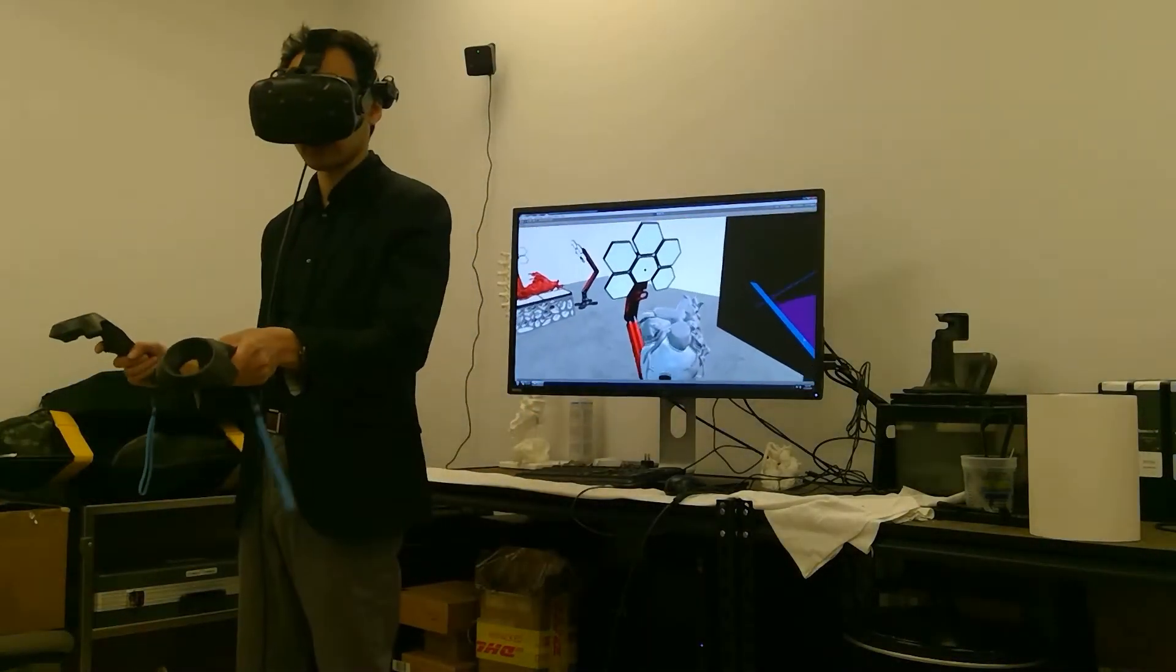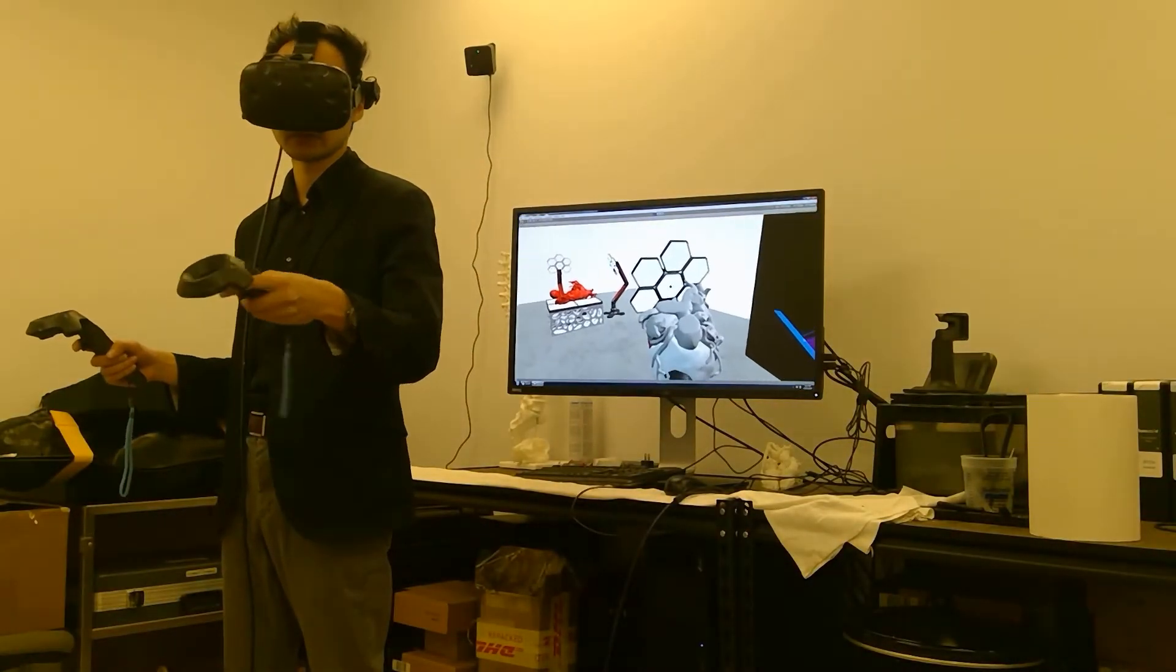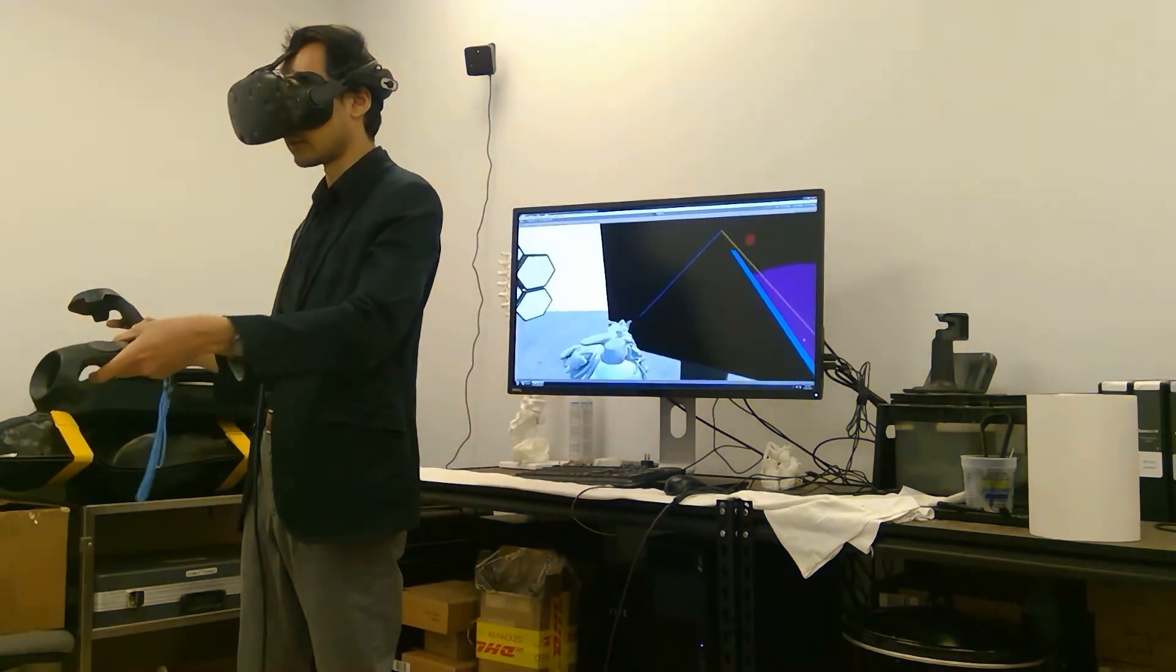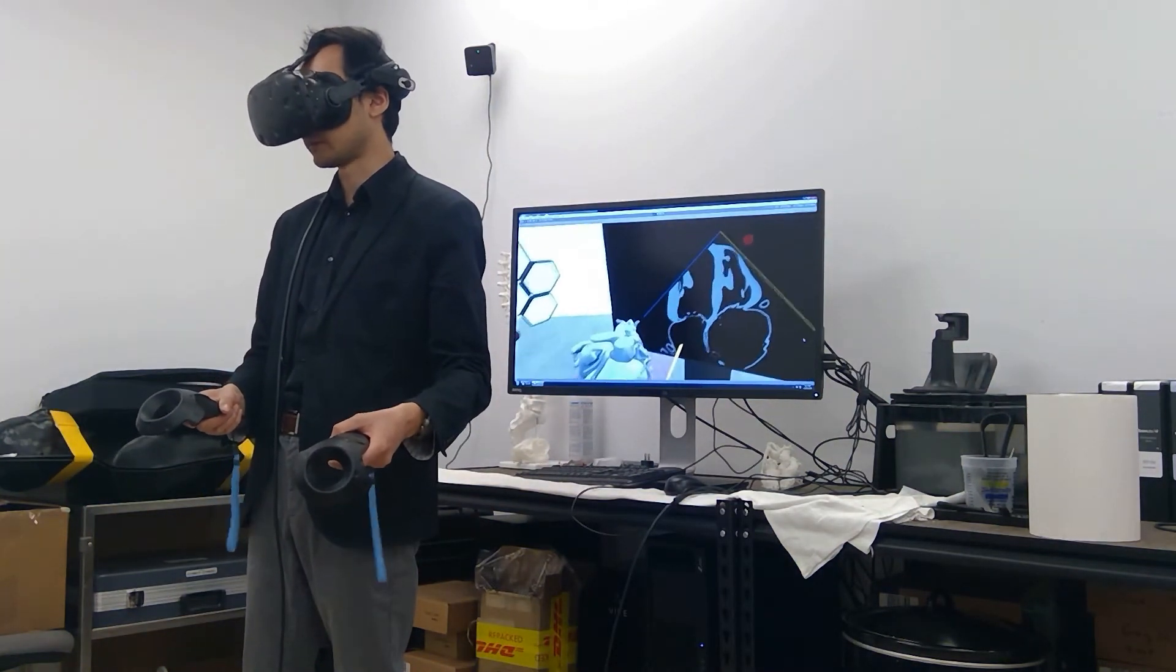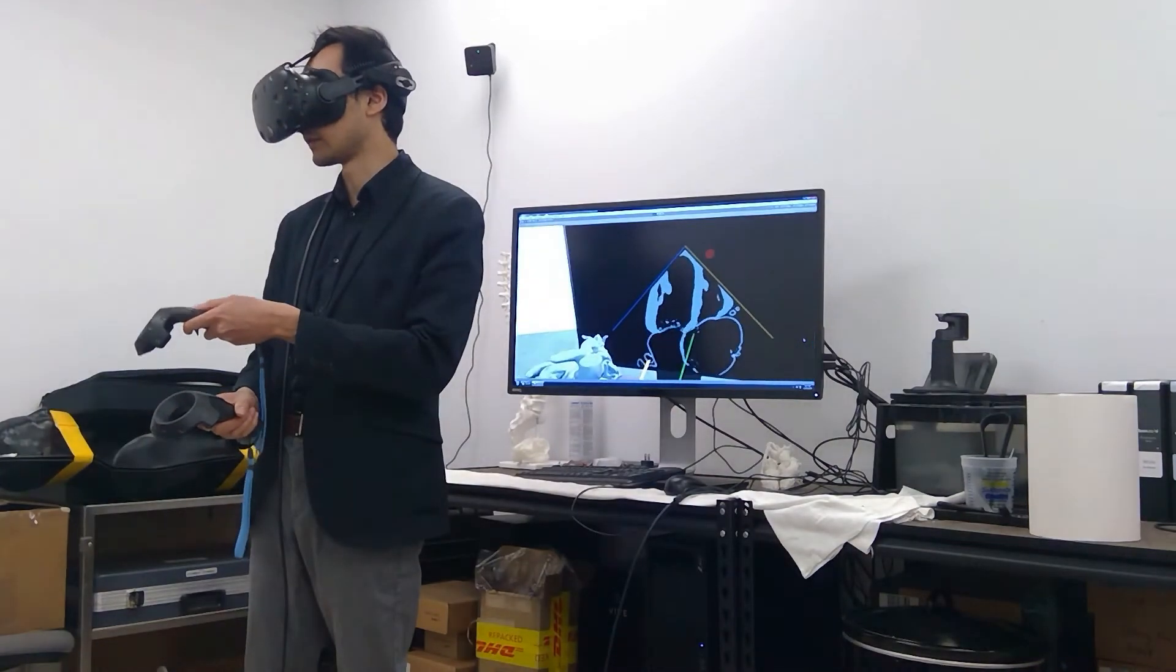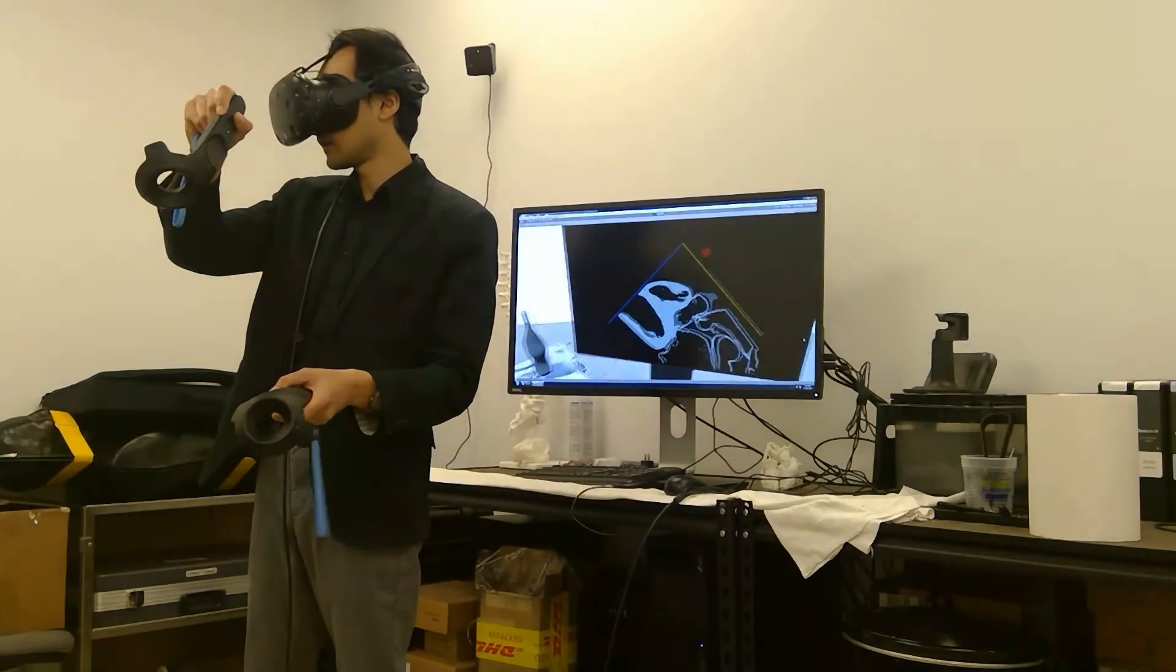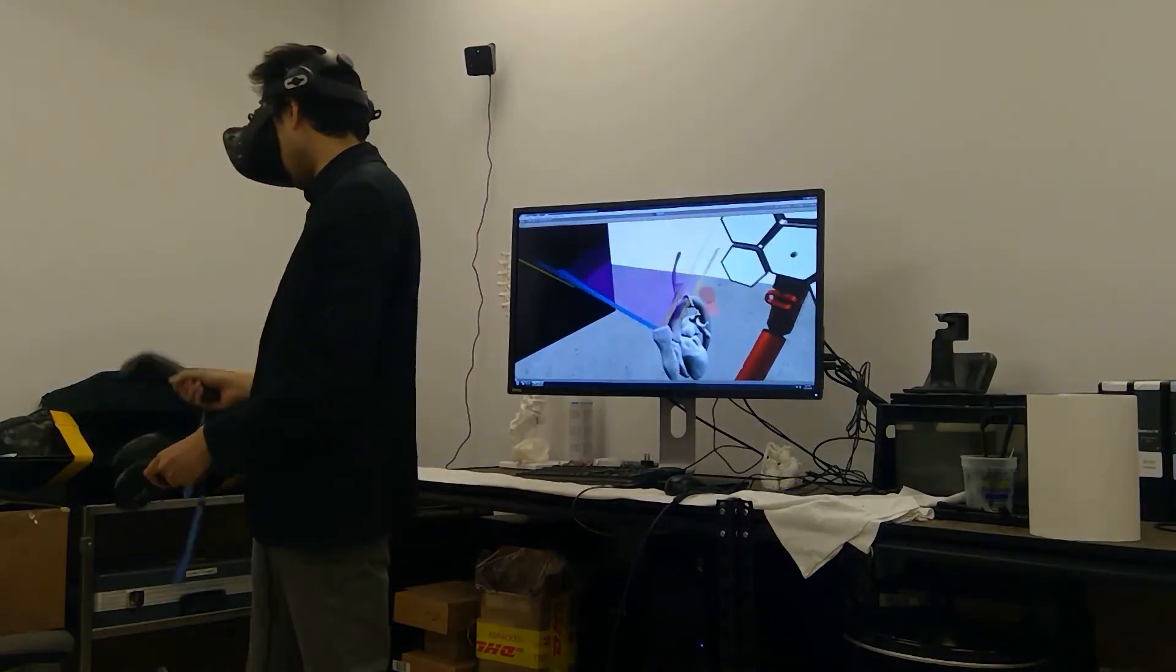And then we can also scan other hearts as well. So in my hand right now, I'm manipulating a heart with dextrocardia. And this was done as a pre-surgical planning model. As you can see, we can manipulate it in mid-air, put it wherever we want in the scene, and then also be able to do a transthoracic ultrasound exam on it. So right now, we can view all the structures of this heart with dextrocardia, a rare congenital heart defect.